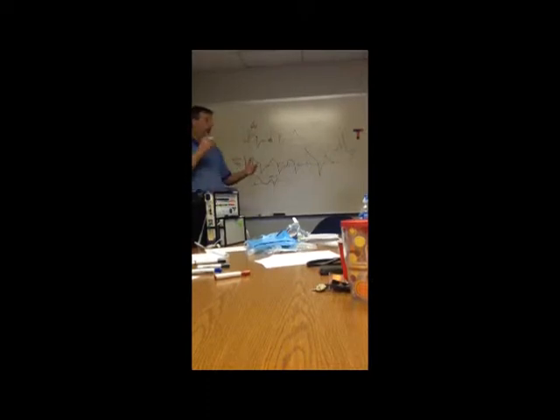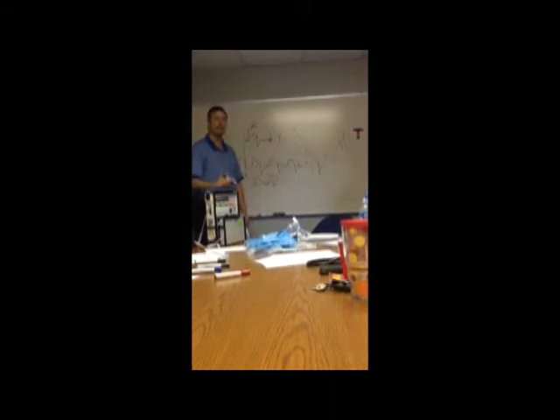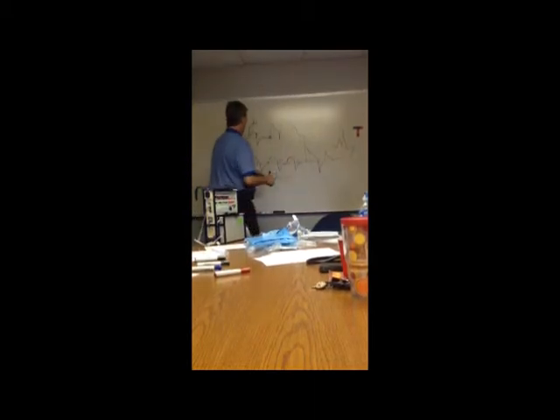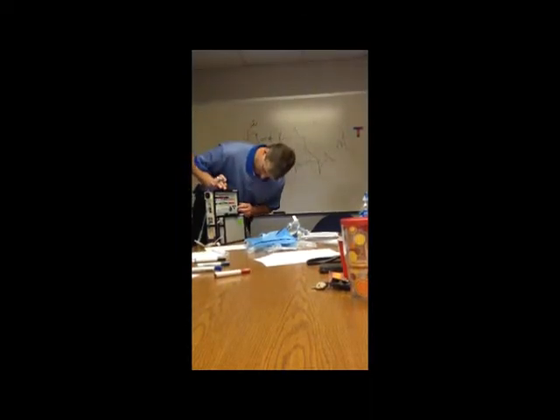With pressure support, when they stop sucking in, it says, all right, you're done. Then the circuit keeps blowing until the pressure goes from negative pressure to positive pressure of whatever you set. By doing that, it tacks on a little bit of extra air to their spontaneous effort, to make a weak effort a little better, to help get through the tubing because that's hard to breathe through. All right, so that's the difference between the two main modes, all right?